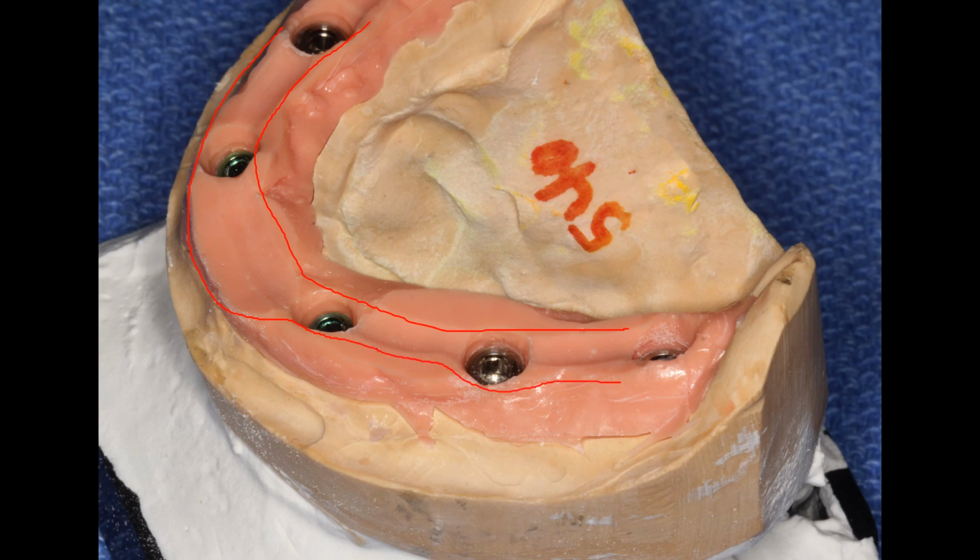And what this allows is that by modifying a little trough here, we can make sure the bottom of the prosthesis is convex. It's another one of my big pet peeves about full mouth implant reconstruction that if the bottom of your prosthesis is concave, there is no possible way you'll ever clean it. There's an easy, very easy way to make it convex, and I just showed it to you.